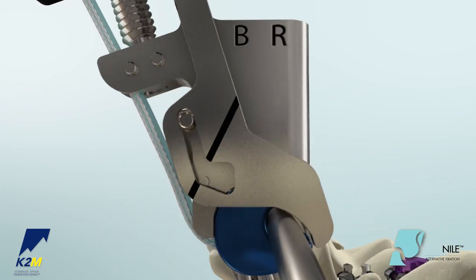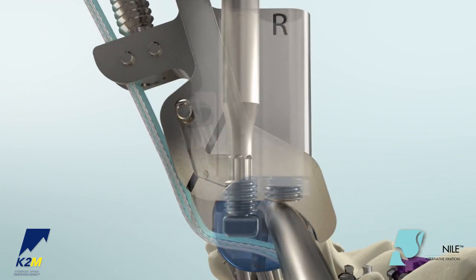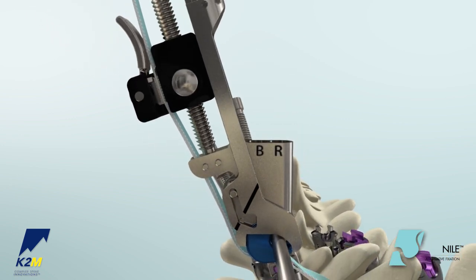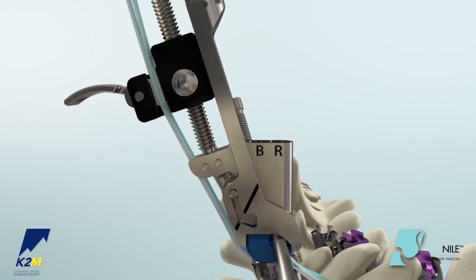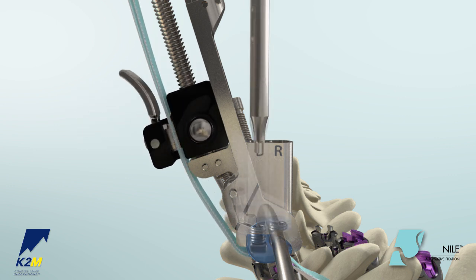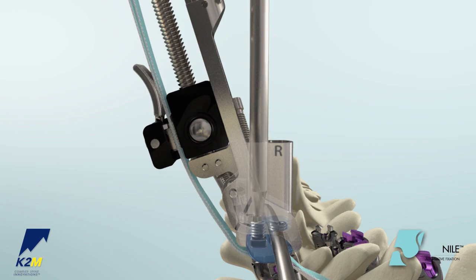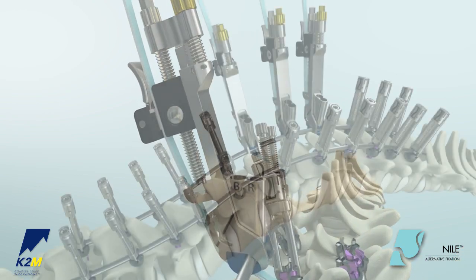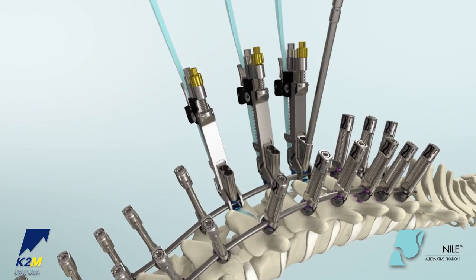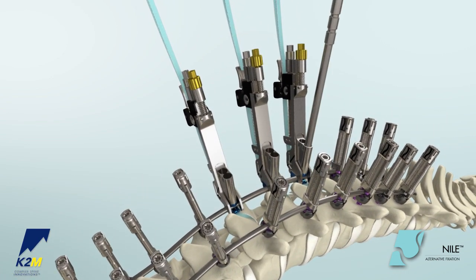If additional reduction is required, provisionally tighten the band set screw through the hole labeled B to hold tension and release the bands by flipping the lever down. Push the button on the side of the carrier and slide it down along the threads. Lock the band onto the tensioner again and loosen the band set screw. Repeat the reduction maneuver. Once desired band tension is achieved, first final tighten the rod set screw through the set screw hole, then final tighten the band set screw.